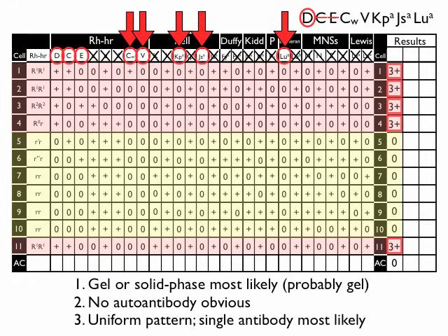For the most part, these antigens are not the targets of antibodies. It would be really uncommon to find these as an issue. And more importantly, if one were an issue, and you were doing a major cross-match, a full cross-match, you would actually pick it up if the antigen happened to be there. So again, not that big a deal, and I don't spend any time worrying about those cells that have very rare antigens.